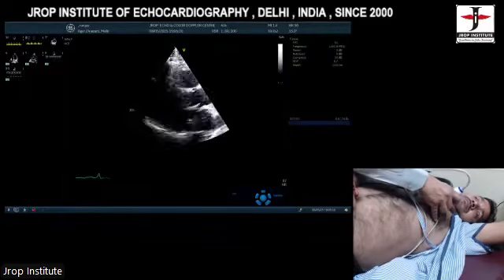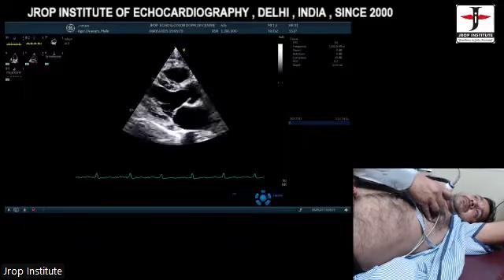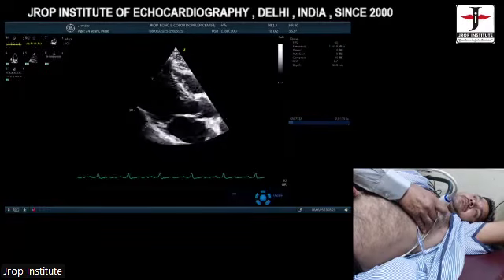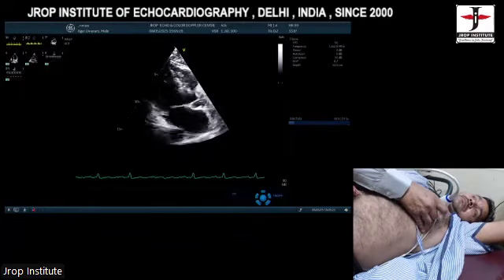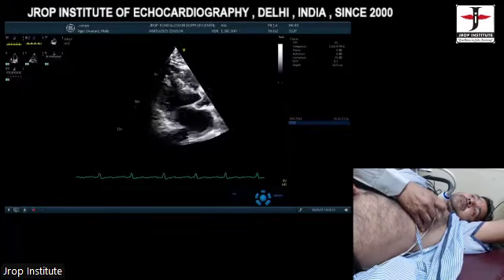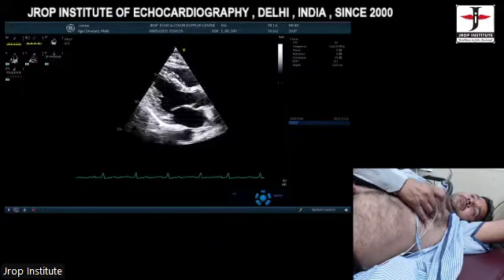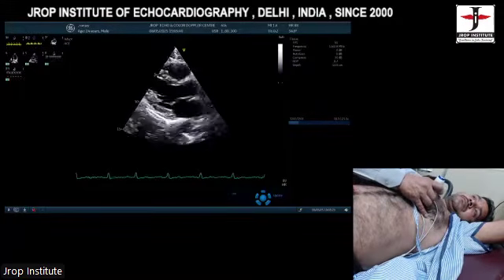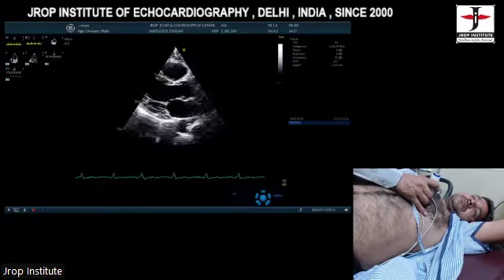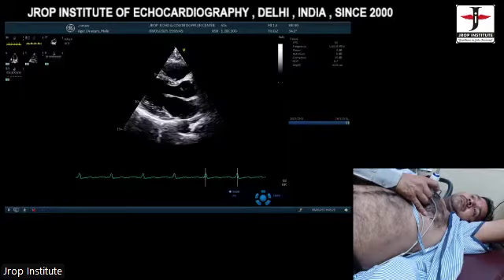Not convinced, not happy. Because you don't make this view like this. What you are fond of is making a view like this. Correct? Are your views like this or not? Yes, sir, mostly. 99.9%, we are one space down. We have to come one space up. And whenever we come one space up, this is the view which is recommended. And that's why she is measuring 3 different dimensions in the same patient.